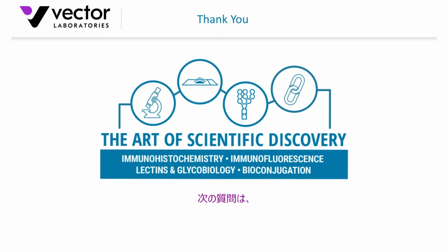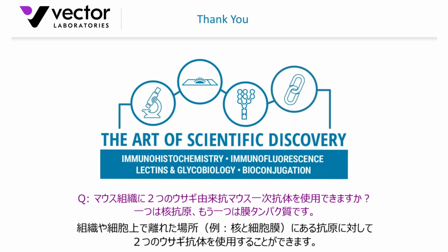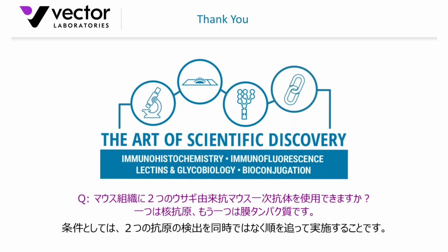Okay, great. The next question is, can you comment on using two rabbit anti-mouse primary antibodies on mouse tissue? One antigen is nuclear and the other is membrane bound. Yeah, certainly. As I understand, primary antibodies raised in rabbit, you're applying them to mouse tissue, on different cellular structures, nuclear and membrane. So yes, certainly you would run these sequentially.